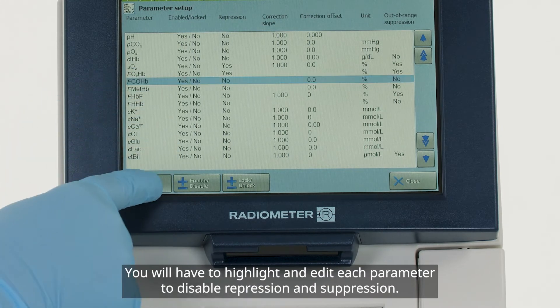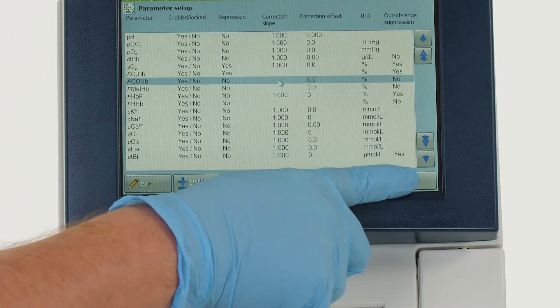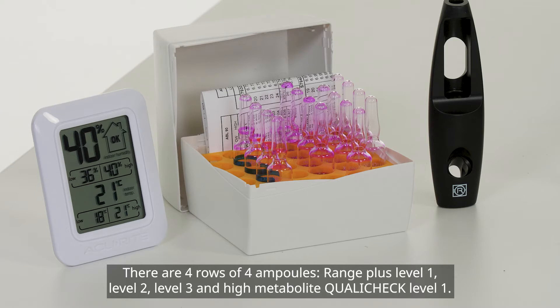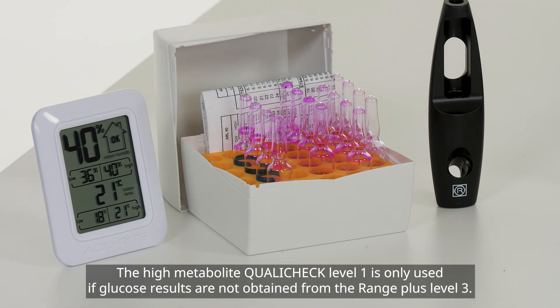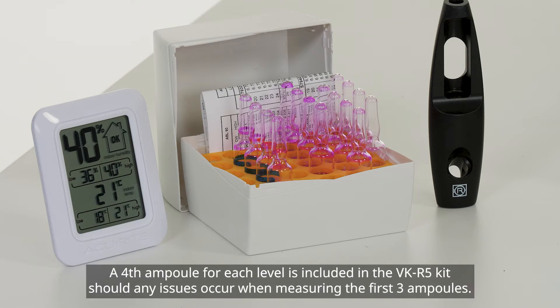You will have to highlight and edit each parameter to disable repression and suppression. The next step is to measure the ampoules found within the VK-R5 kit. There are four rows of four ampoules: Range Plus Level 1, Level 2, Level 3, and High Metabolite QualiCheck Level 1. The High Metabolite QualiCheck Level 1 is only used if glucose results are not obtained from the Range Plus Level 3. Only three ampoules of each level are required; a fourth ampoule is included should any issues occur when measuring the first three.